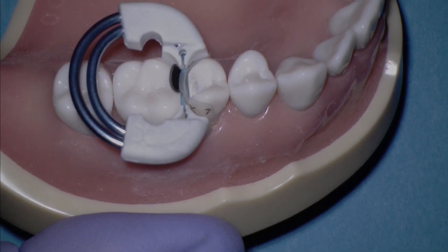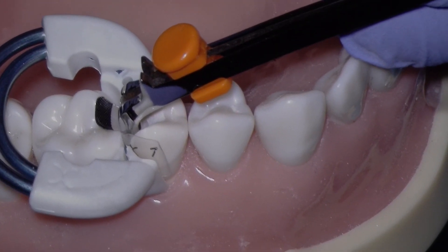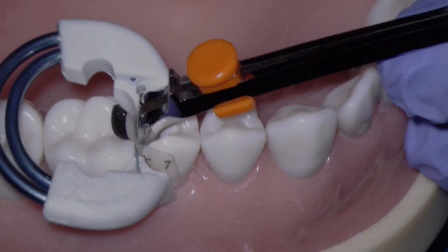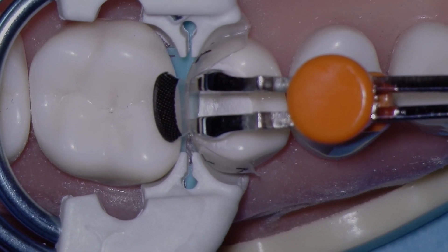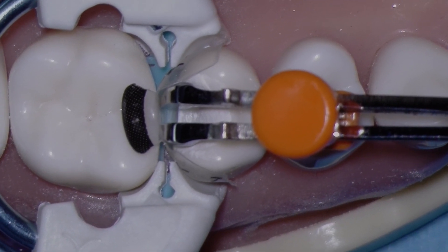Let's take a lateral view of this. The hands of the push-pull instrument should be parallel to the contact area of the neighboring tooth. To accomplish this, we don't want the handle to be too low or too high. It's a good idea to practice before you begin the restoration. Let's zoom in and watch how beautifully we're able to adapt and approximate the matrix with the new adjustable push-pull instrument by Bioclear.